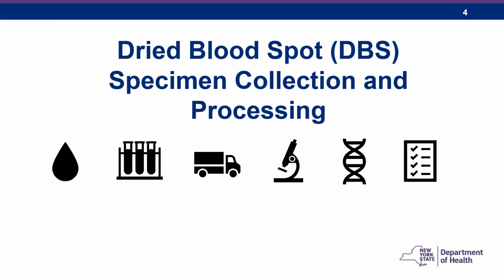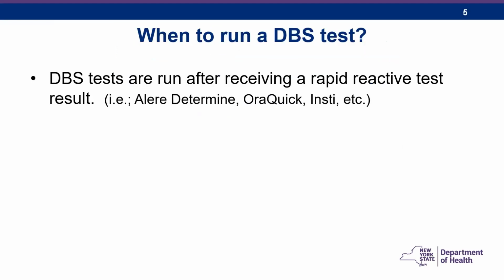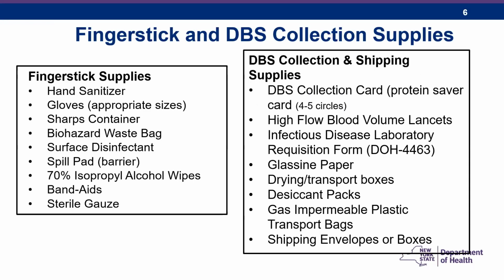So our first is specimen collection and processing. So when do you run a DBS test? DBS tests are run after receiving a rapid reactive test result. Fingerstick and DBS collection supplies. So these are all the supplies that you'll need. Feel free to take a moment to review these for your fingersticks and setting up your testing environment, as well as for DBS collection and shipping supplies.